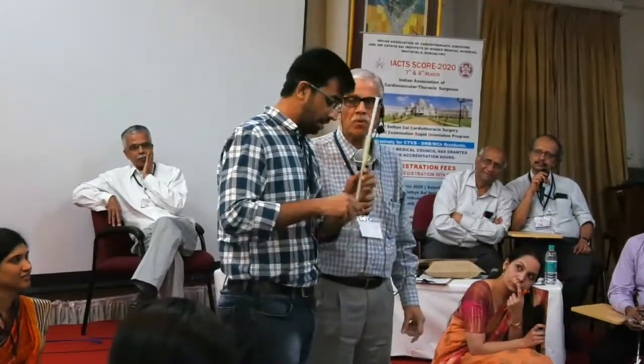Next, I'll take a partial clamp. Clamp the RA appendage. I'll cut the tip of the RA appendage. Why do you want to cut? You can see. They will cut the top of the tip of the RA appendage.